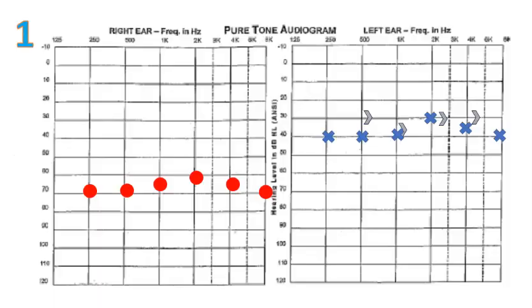However, these unmasked bone conduction results may be coming from the right side. They may be coming from the right cochlea. Even if that's the case, it means that the left ear would have either equal or poorer bone conduction hearing than the right ear. So either way, they may be coming from the left side, they may be coming from the right. We identify that the left ear has a sensory neural hearing loss either way. We don't know the status of the right ear at all at this point. We'd need to do masked bone conduction on the right side to find that out.